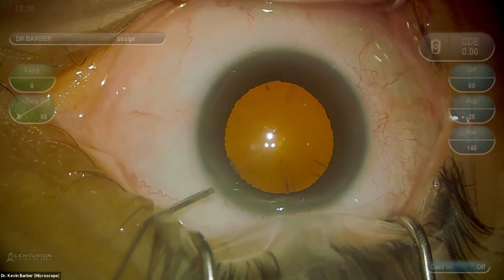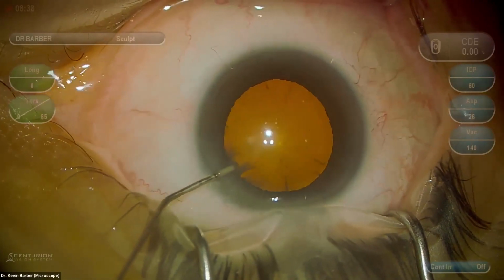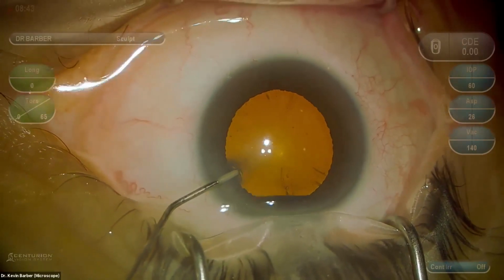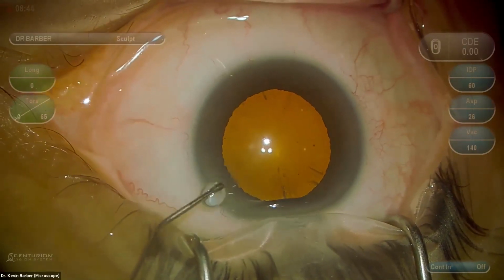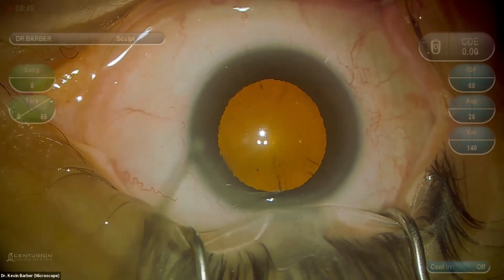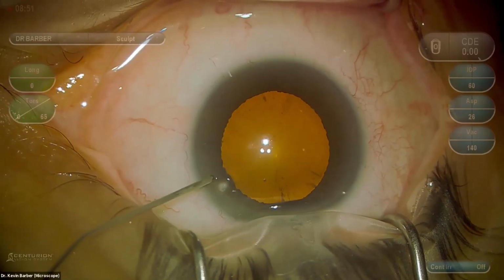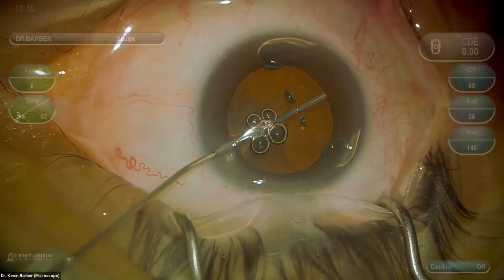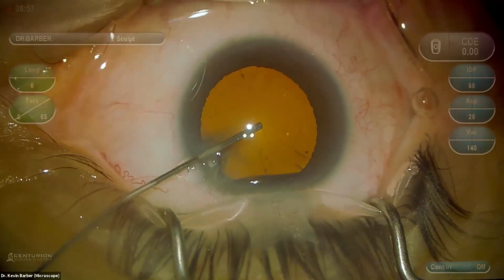Okay, I'm going to give you just a little bit of numbing medication here. So I'm injecting a little bit of non-preserved lidocaine. I do that on all my MIGS cases, just because we are going to be manipulating the anterior chamber a little more than with a standard phaco. This is my OVD. I'll disperse it.